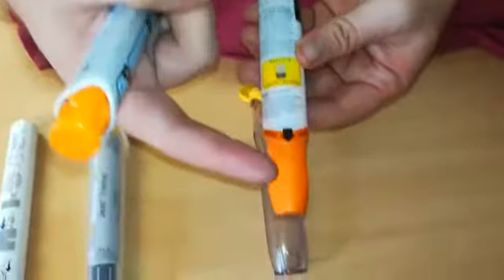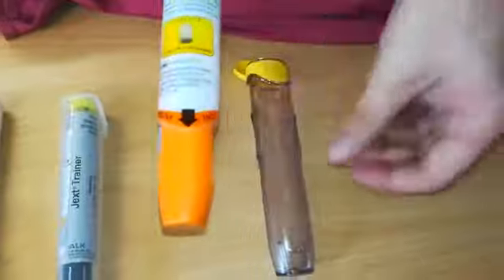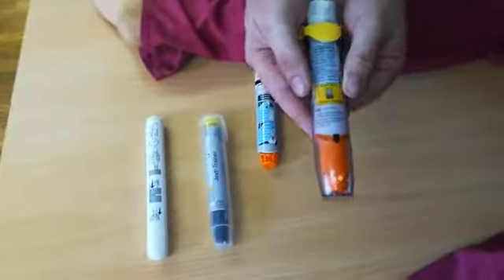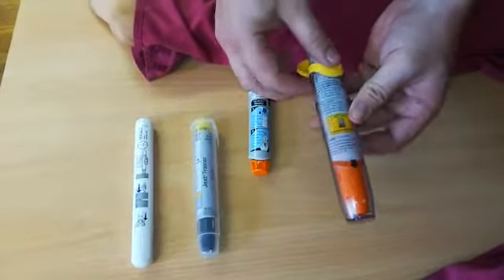Once you're finished, as you can see, the needle is still in there. That is just a bit of plastic, so it's still dangerous and has to be securely put back in its case and disposed of correctly — returned to the patient's doctor, or given to the ambulance crew or hospital.